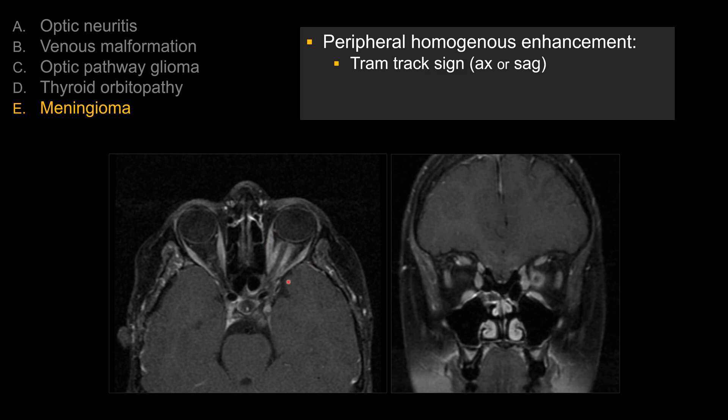First of all, you do see abnormal enhancement surrounding the left optic nerve. When I see an orbital lesion, one of the first things I do is determine the lesion's relationship to the optic nerve — does it arise from the optic nerve itself or from outside it? It's the same approach I use with brain lesions: is it intraaxial or extraaxial? And with spinal lesions: is it intramedullary or extramedullary?